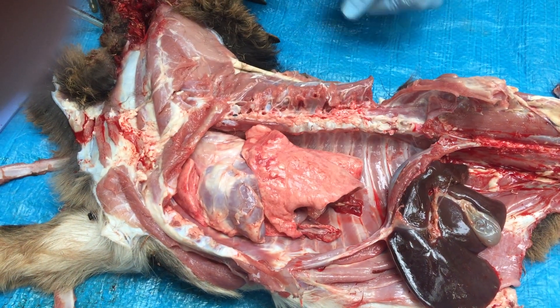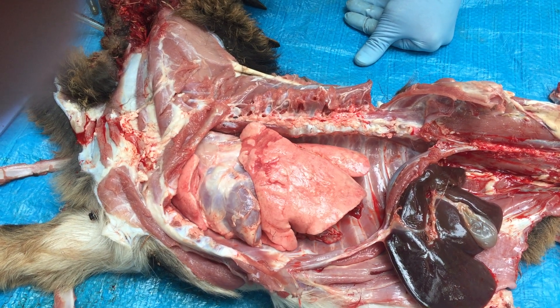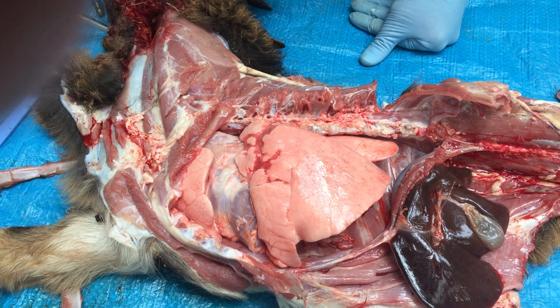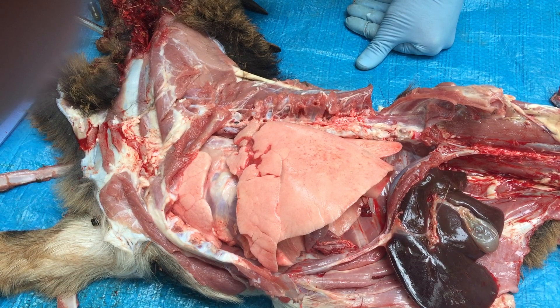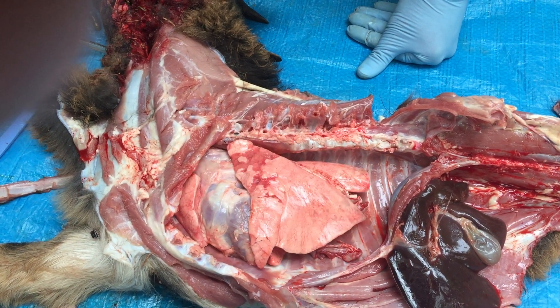We're going to start off with no PEEP, just bagging — so that's zero PEEP, just IPPV. You can see the lungs just deflate right back down to normal.